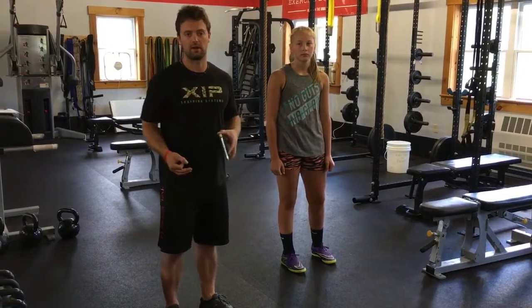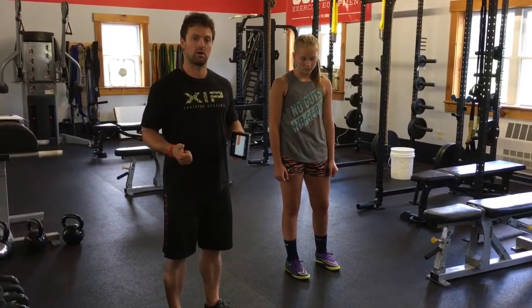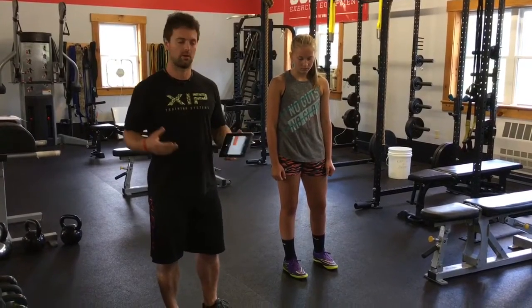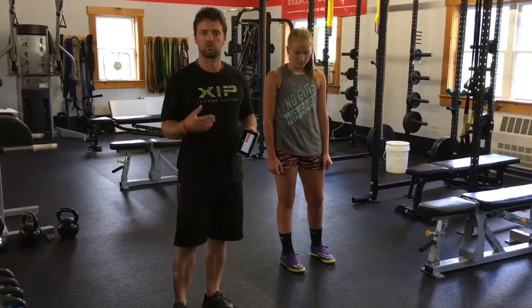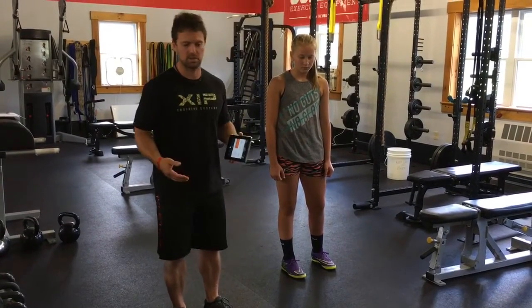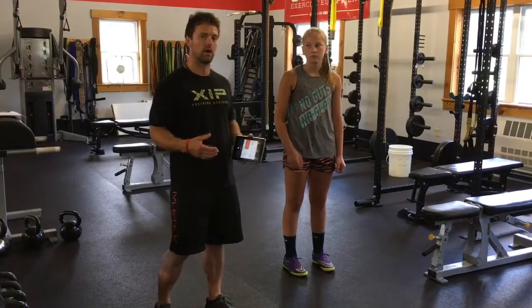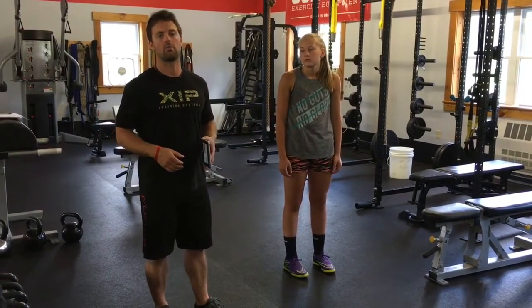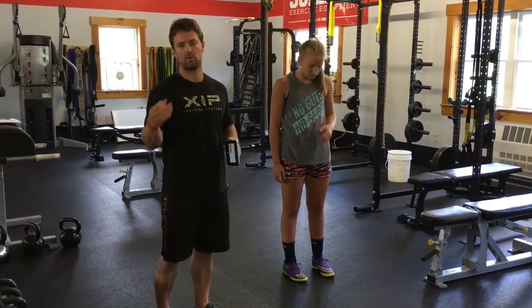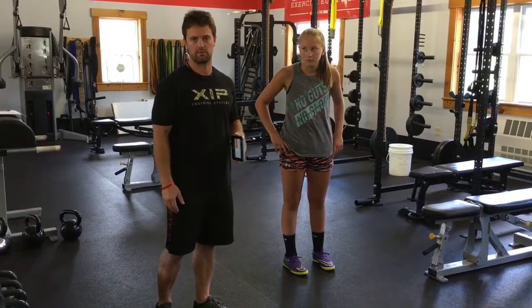But one thing we haven't done is tested her symmetry in terms of power from one leg to the other. There are plenty of ACL tests used for the return to play process — line jumps, triple jump, standing single leg jump. In this case, we're going to do a single leg counter-movement jump, and we're going to look at her power and velocities created from one side to the other.